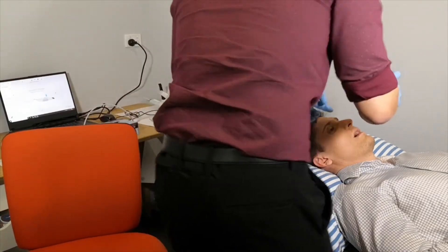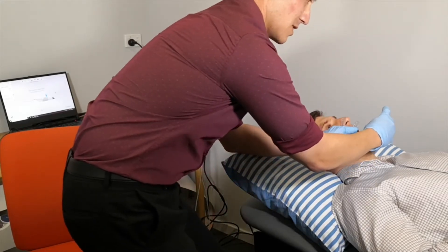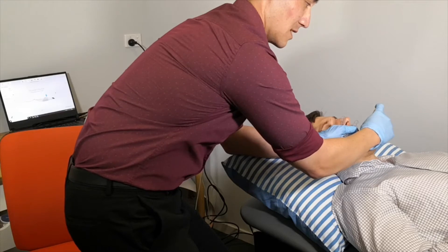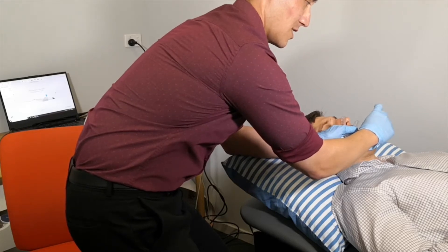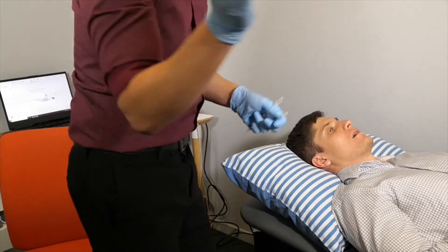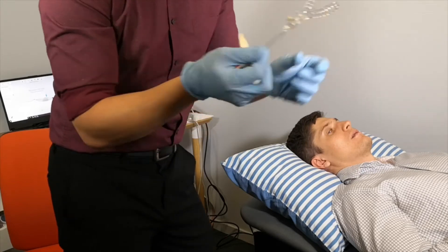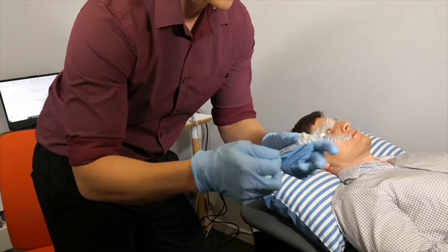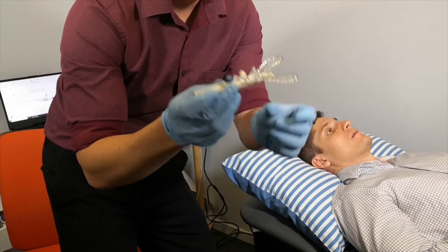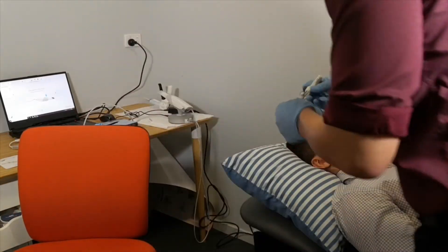So it's just simply at the front of the lower incisors there. You would disengage this and just have it engage the teeth nice and tight and then just tighten the bottom ring. Now this part is done. You loosen up the top one. You've got the bite fork here, so now we need to insert this into the patient's mouth. But firstly we can put it all together so that it's all one piece.